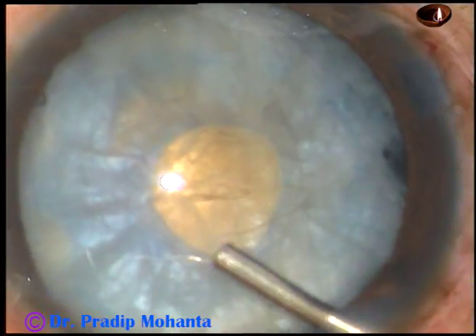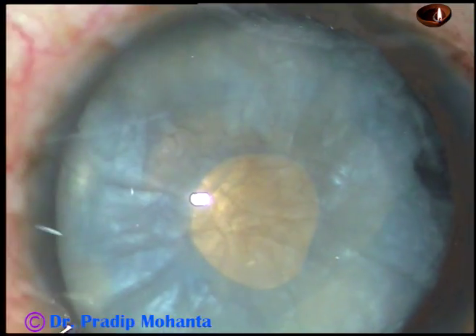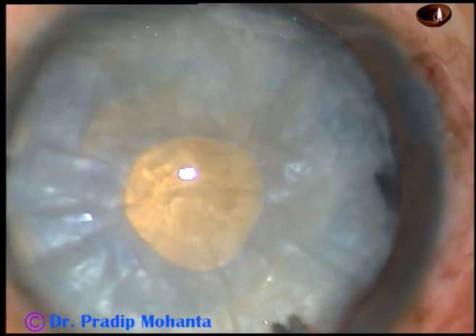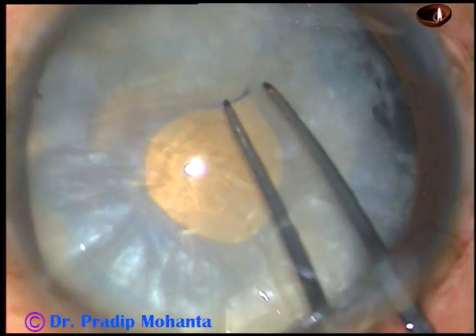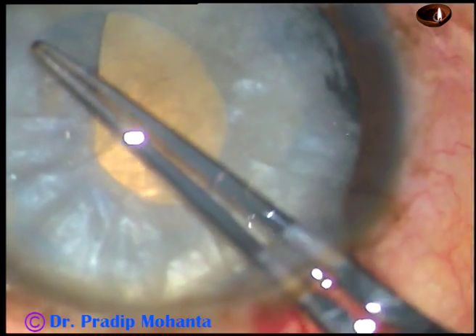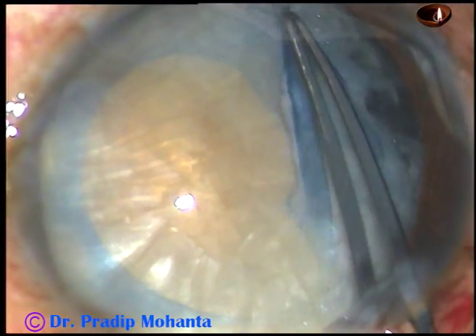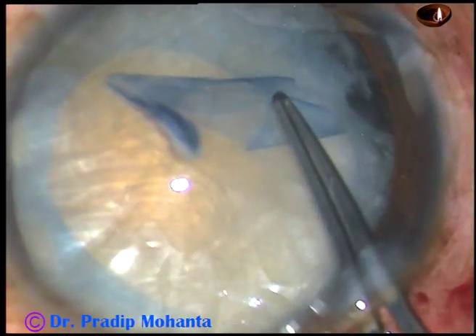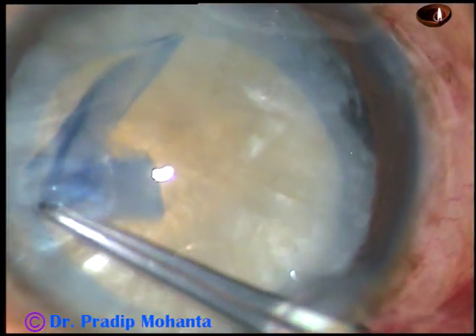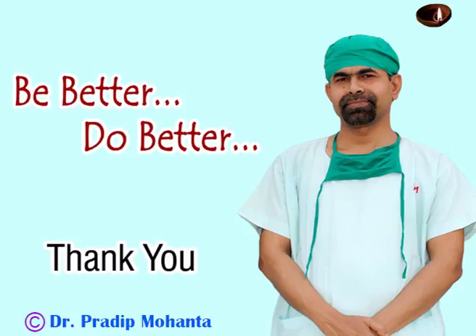And now again HPMC is injected. Take a Vannas scissor and make a very small cut at the margin of this rexis. And now hold this and enlarge this mini rexis into an optimum-sized capsulorexis. That's it. In this way, we can do rexis in all intumescent cataracts. Thank you very much for watching. Hope this video will encourage you to do two-staged capsulorexis.